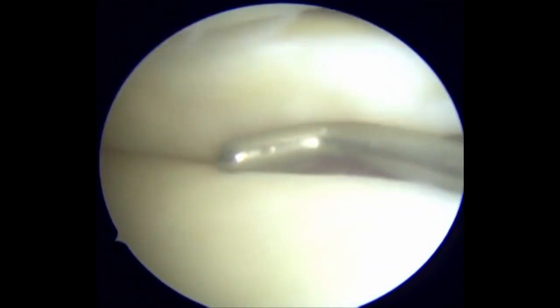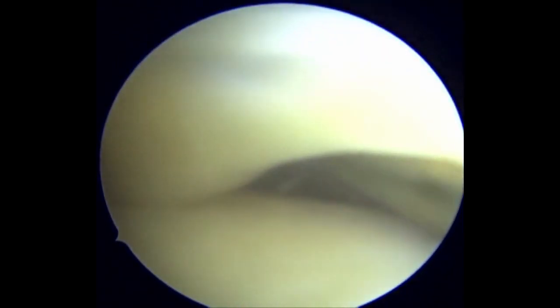However, it re-displaces easily. After multiple attempts, the meniscus flap is successfully reduced into the joint.